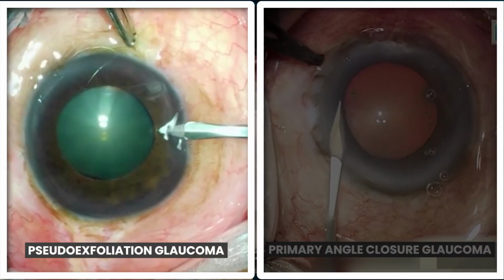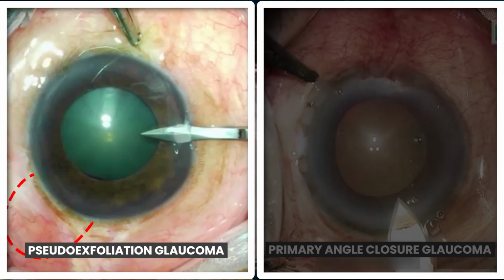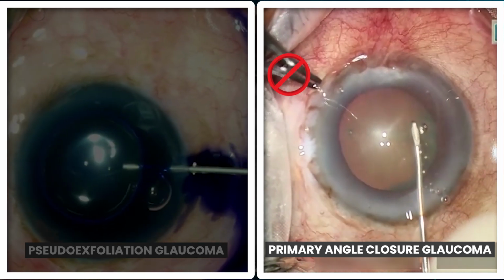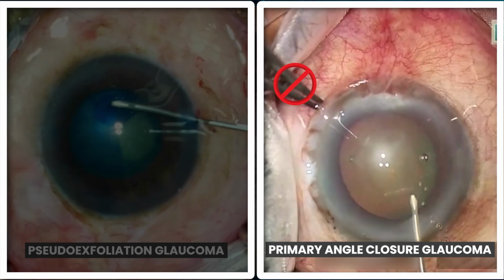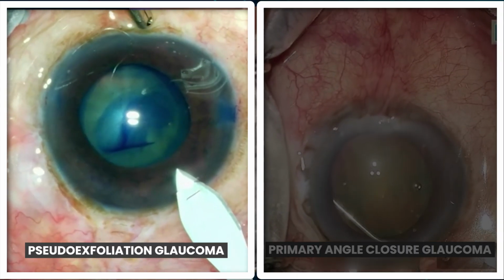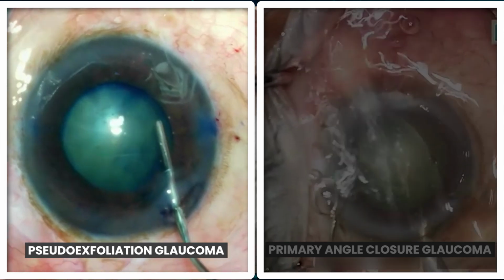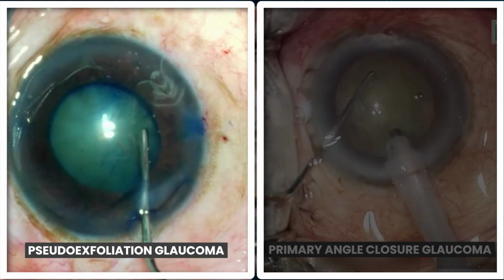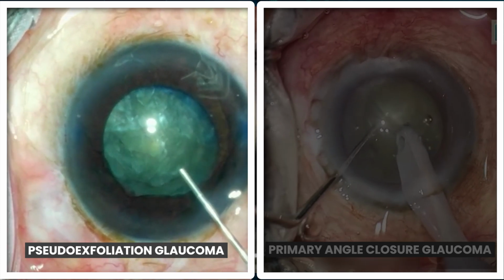During surgery, the forceps used for globe fixation should be applied away from the trab site. Avoid handling the conjunctiva near the bleb as small tears can lead to post-op bleb leaks. The corneal incisions should be made 1 to 2 clock hours away from the bleb. A combination of dispersive and cohesive viscoelastics with the soft shell technique can be used to protect the endothelium.